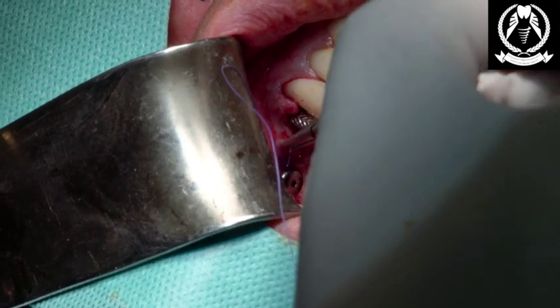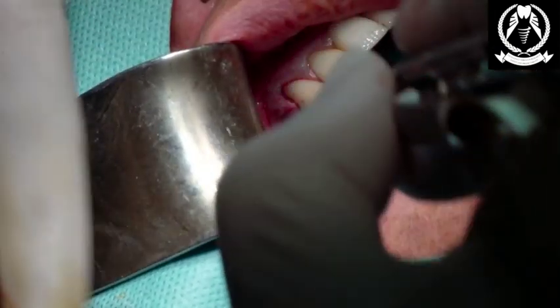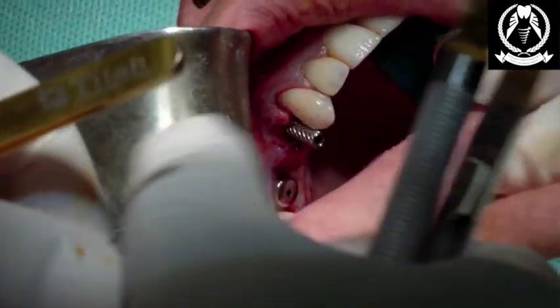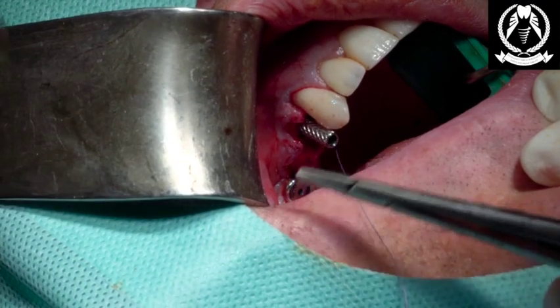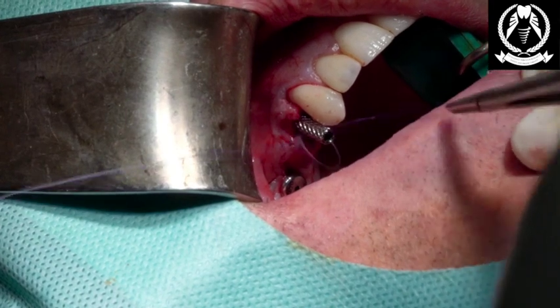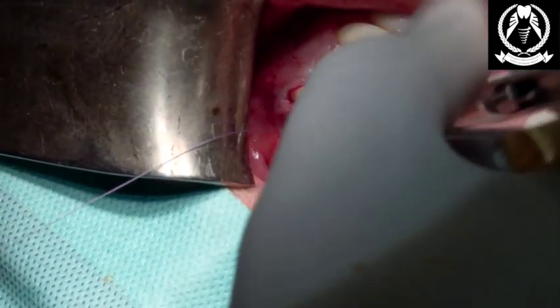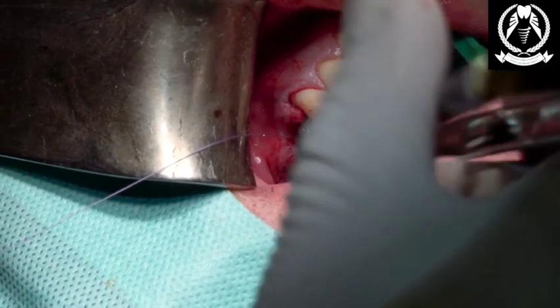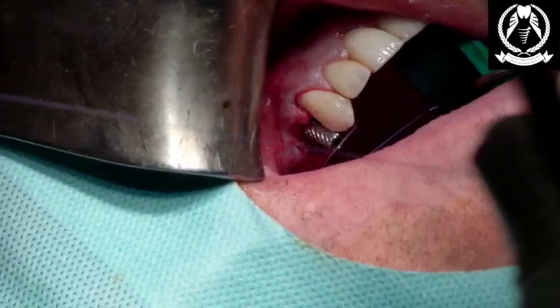Is that through on the palatal? Confirm. The beauty of this material is no membrane, no faffing, and we've just done a beautiful sinus lift and two very solid implants. So Alan, I reckon these will be ready and cooked to completely restore in 5 to 6 weeks. It's literally the time. Okay there, Alan.